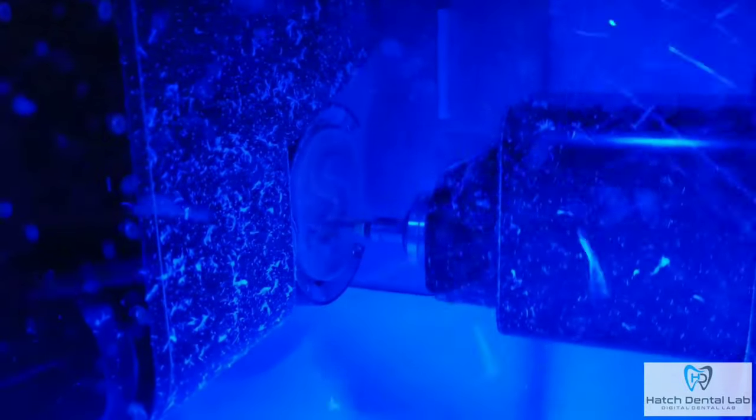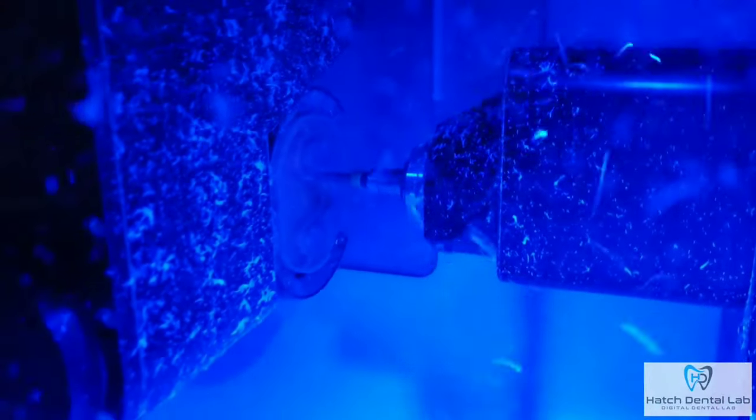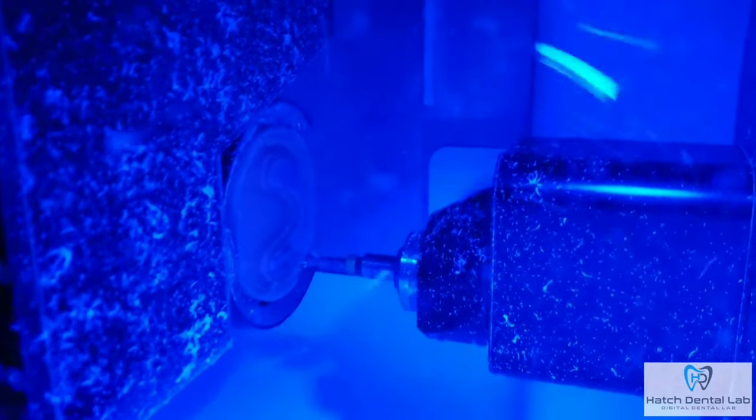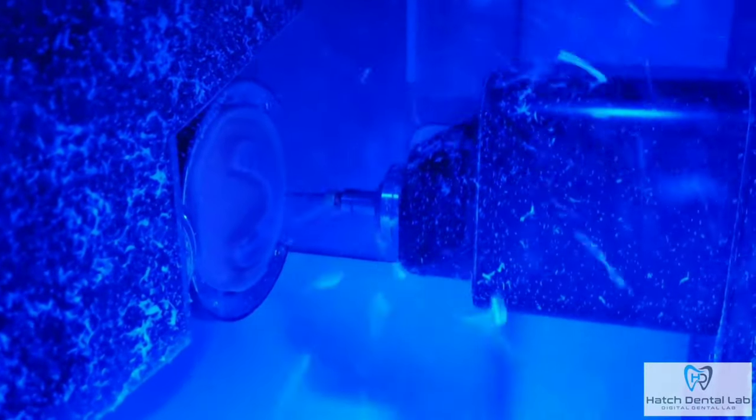Another one of the things we love most about the digital denture process has been the balanced occlusion — never have we seen it so good, and that's for two reasons. One, the teeth are not shifting after the wax try-in during the processing stage. And two, the virtual articulator and 3Shape software allows for centric and lateral excursions to virtually remove any premature contacts, therefore saving you, the dentist, valuable chair time.